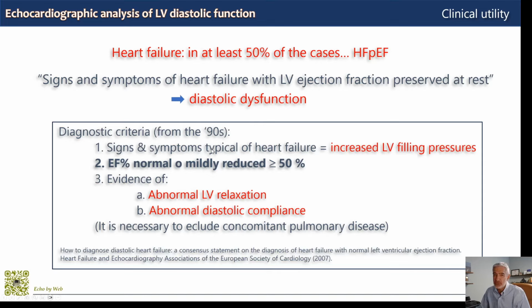cardiac catheterization was no longer necessary to measure relaxation or calculate diastolic compliance. From then on, non-invasive echocardiography was deemed sufficient, and this was very important because this boosted diastology and the use of echocardiography. Catheterization is now today reserved for specific and complex situations such as differential diagnosis between constrictive pericarditis and cardiomyopathy, or to complete a diagnosis of a phenotype of restrictive cardiomyopathy.